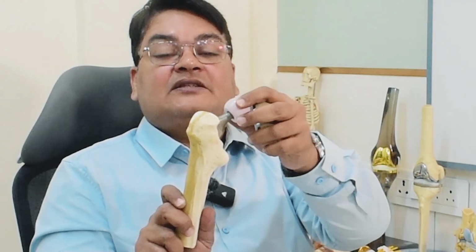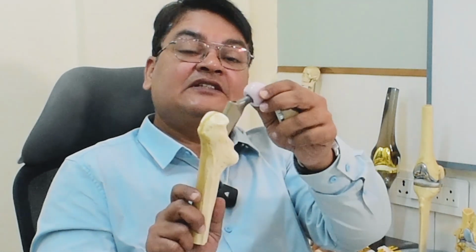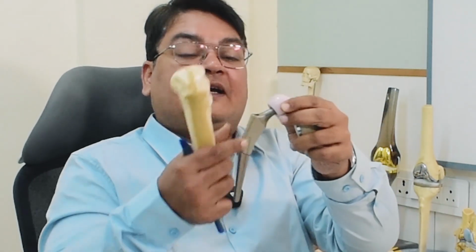This stem is put inside the thigh bone like this, and it can be put in two ways. One is by using bone cement, which is known as a cemented implant, and another one is press fit. In press fit there is no cement. This is calcium hydroxyapatite coated, and bone ingrows in that. That is known as uncemented.